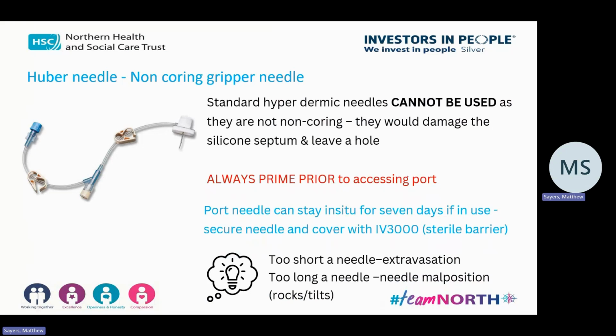So the things to think about, and the good thing about Encompass is that you should readily be able to find all the information that you need. The information from the Royal should come down about the needle length and things like that. So it shouldn't be any guesswork.